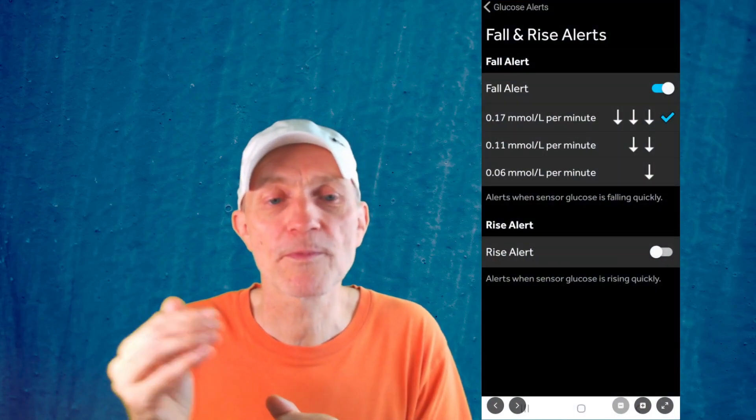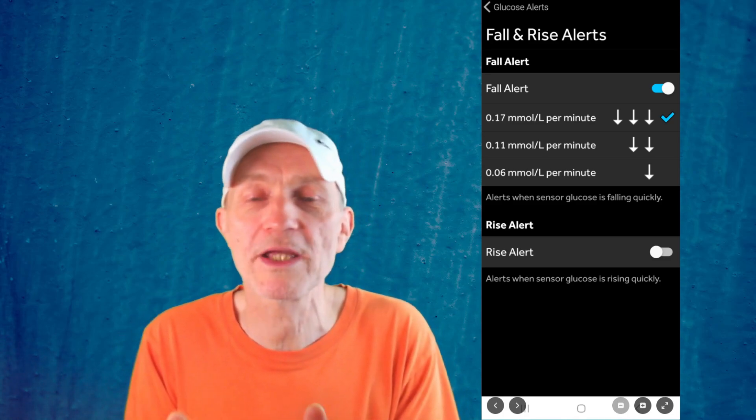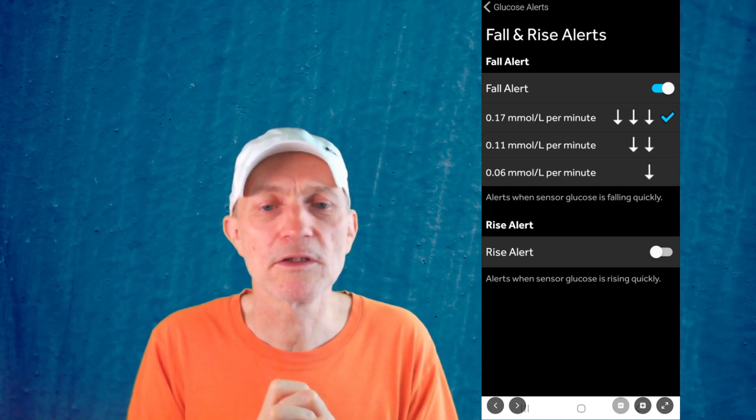A great thing about this app is that it has really good control of the alarm sounds. You can set the glucose level at which the alarms go off, and you can set alarms for glucose rising or dropping quickly — I find that really nice. You get this on the Dexcom G7 as well, but not on the Dexcom One Plus or the Freestyle Libre 2 or 3, to the best of my knowledge. You can also snooze the alarms and set a different alarm volume for nighttime — so if you go into a meeting, you can silence it for half an hour.